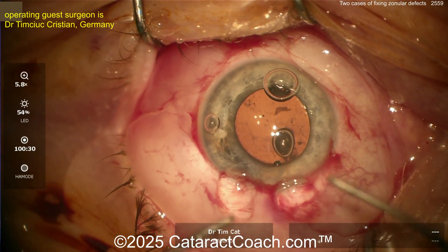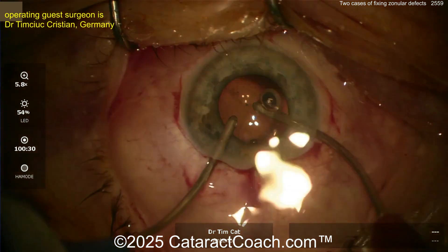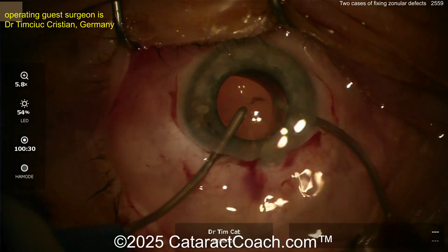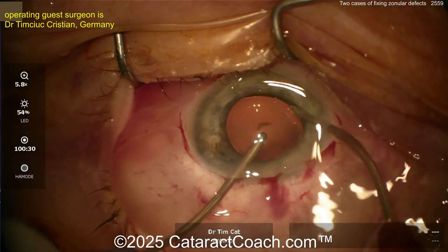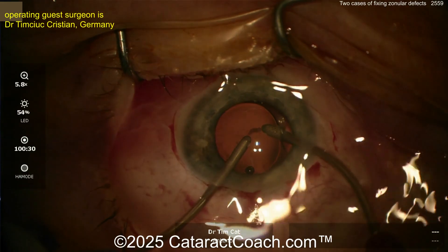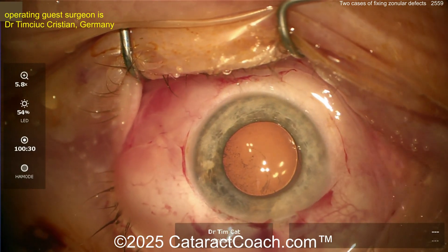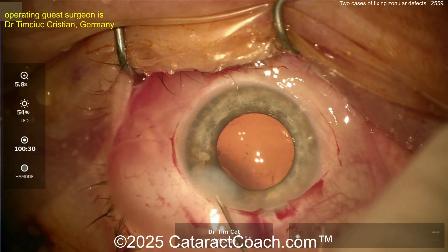You may have to put in a capsular tension segment and then suture that into position — suture it to the sclera — depending on how much stability you have. Now the lens is in the capsular bag; going inside gently, removing the viscoelastic. It's okay to leave a little viscoelastic and give the patient Diamox in the post-op period. If needed, you could put in a capsular tension segment and suture that into position. Going behind the optic for that one last piece — let's see the stability. Does it look stable enough? It looks pretty good, actually.